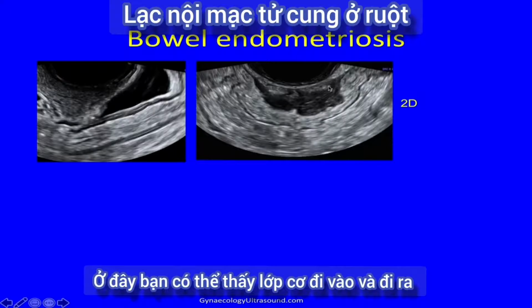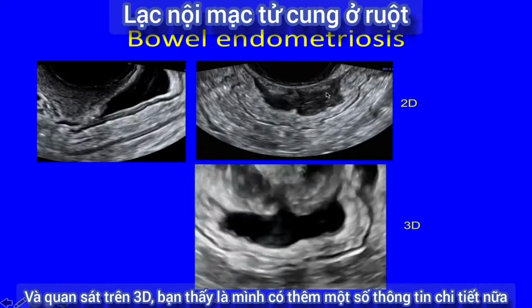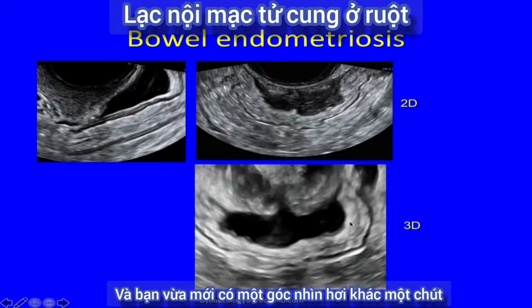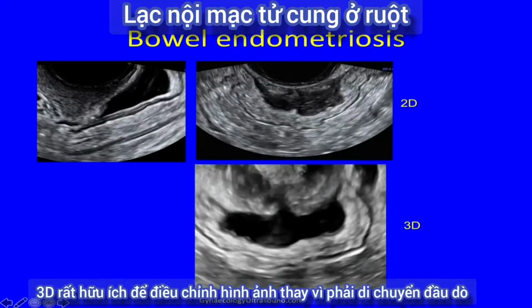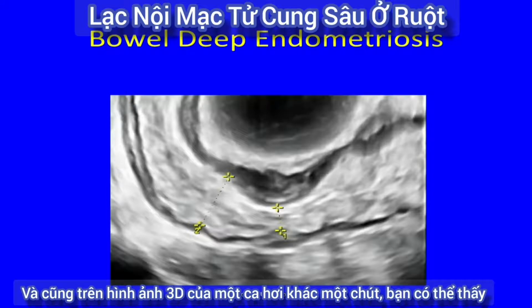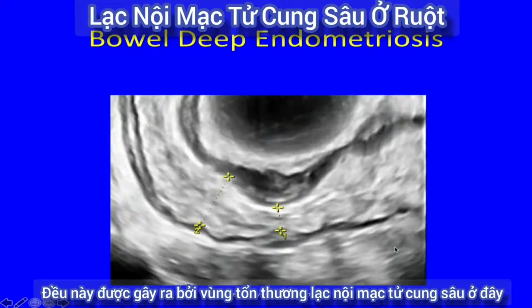Bowel endometriosis affects the muscularis layer. So here you can see normal muscularis going in and going out, and all of this is hypertrophied muscularis caused by deep endometriosis. And when you look on 3D, you can see that you get a bit more detail. Also, you've got muscularis there and there. You can see some deep endometriosis in the ligaments, and you just get a slightly different view. And it's very useful with 3D to be able to manipulate this image rather than move the probe, which in some patients can be very painful. And again, on 3D in a slightly different case, you can see here that there's stenosis of the bowel compared to just distally there, and that is caused by this deep endometriosis lesion.